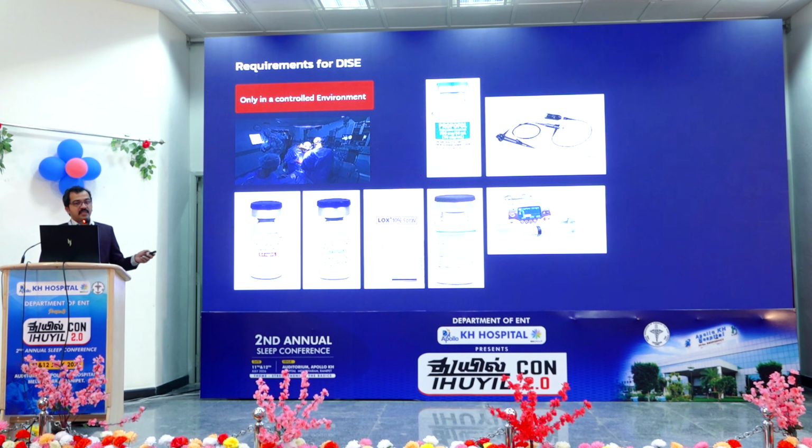A target control infusion system. This will help in maintaining a continuous flow of the IV sedation. This will usually be there in your theatre, because whenever you have a TIVA or total intravenous anesthesia, they are usually using this system. So you can use that, and this is recommended.